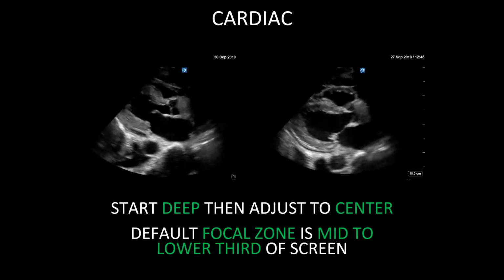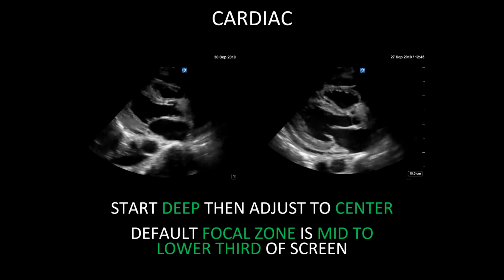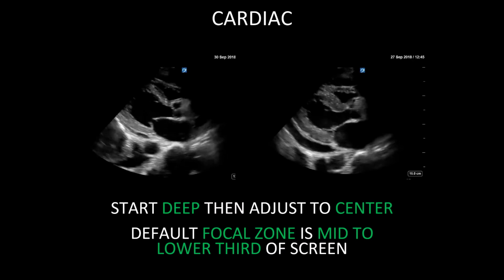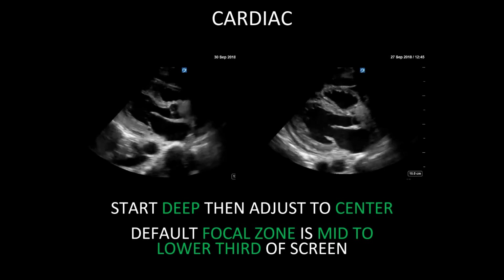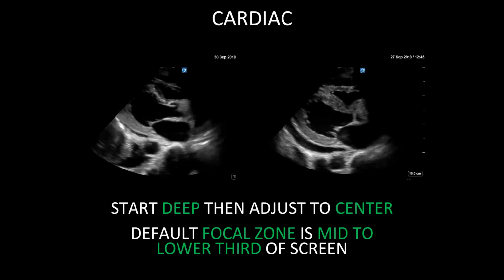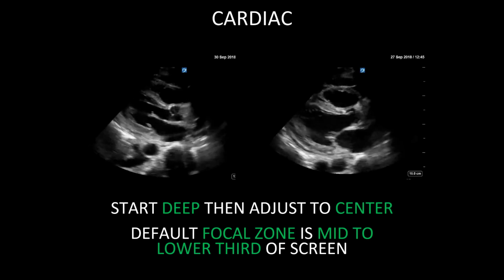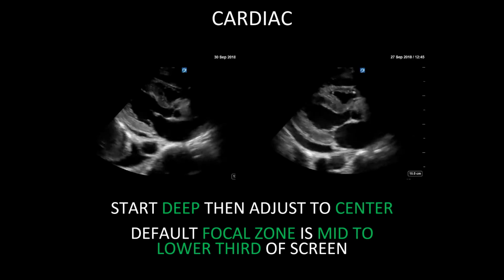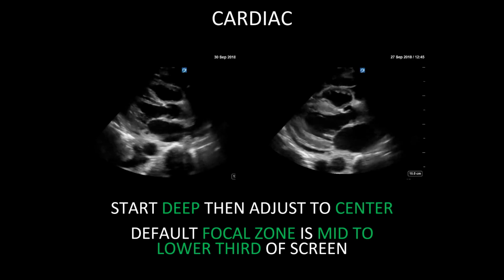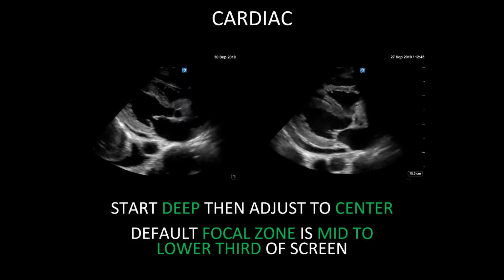Classically, a pleural or pericardial effusion may be missed on a parasternal long axis view of the cardiac exam. Indeed, starting with a deep image on that view is part of the standard image acquisition sequence in some labs. Only after this should you optimize the image so that it is centered and occupies most of the screen. The cardiac view depends very highly on the location of the assessment, given its multiple potential windows and views. A specific standard for depth is thus hard to give, as it varies between views and body habitus.